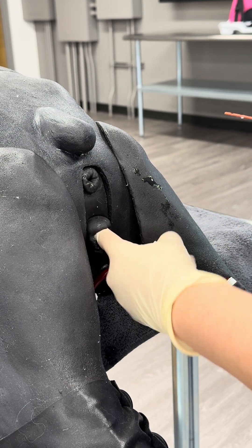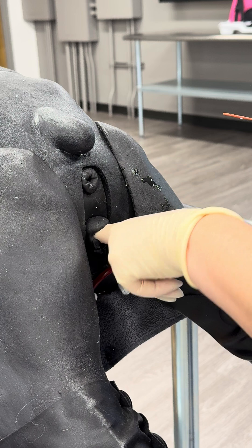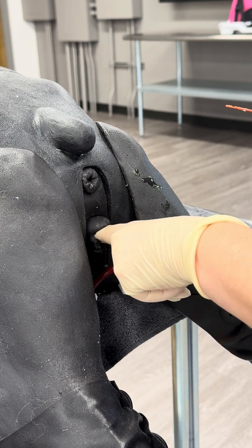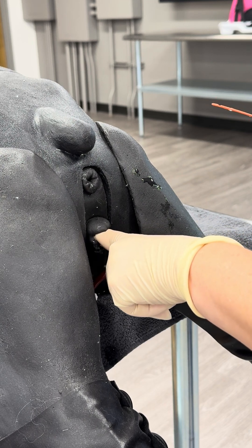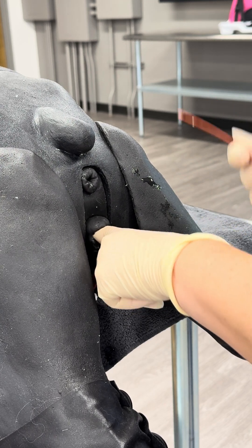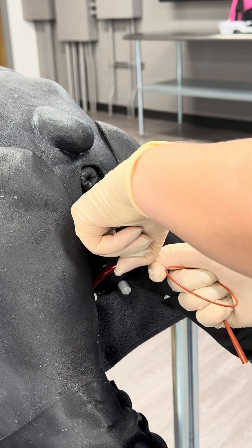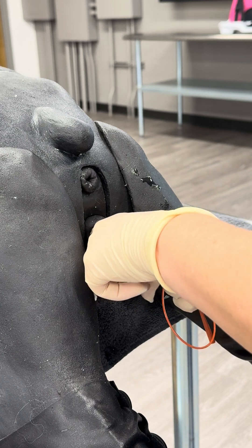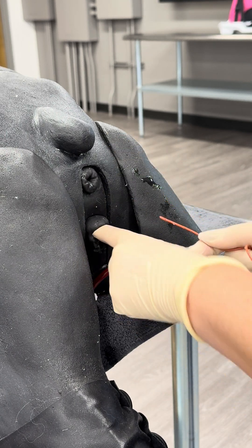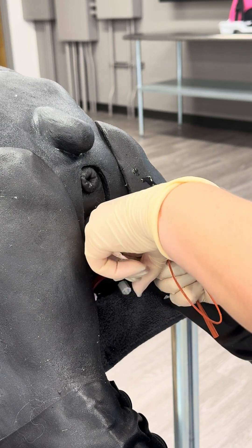There is a urethral papilla. If you take your finger and sweep it back and forth across the floor of the vagina, you will feel a soft tube-like structure that's exactly on midline. Sometimes it's easier to palpate than others. Now that I know approximately where my urethral papilla is, I'm going to guide this catheter into it. The point of my non-dominant finger is to prevent this catheter from going up into the cervix and vagina.